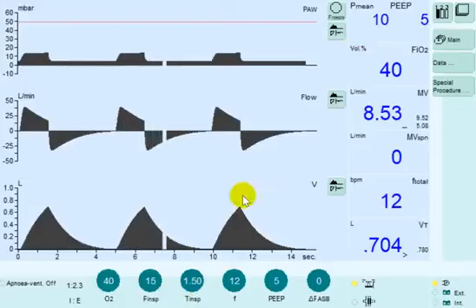We have a patient who is on pressure control mode of ventilation. You can see how the pressure goes up to 15 and stays at 15 centimeters of water for the duration of inspiration, which is 1.5 seconds.